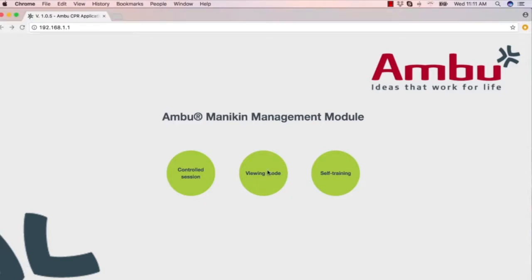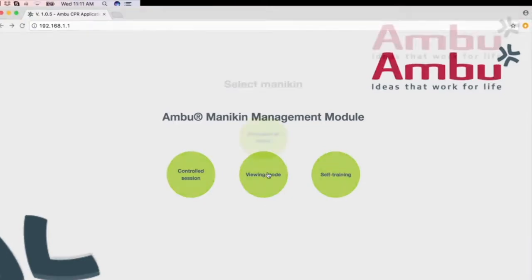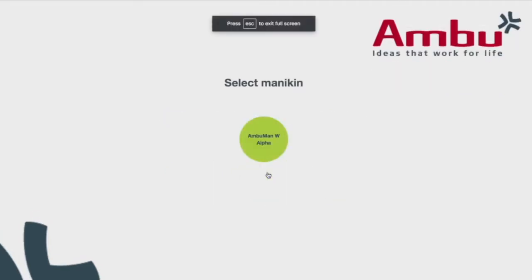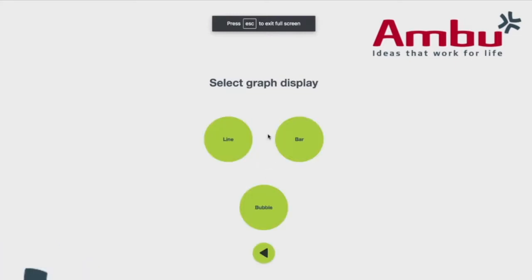You click on the viewing button and it takes you to the next screen. That next screen is going to ask you to select which mannequin you're working on. That mannequin in this case is AmbuMan W-Alpha. You select that.